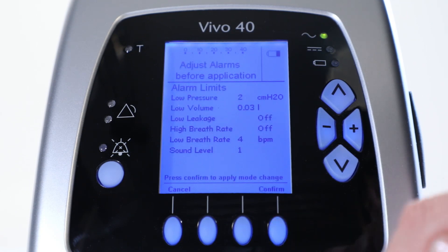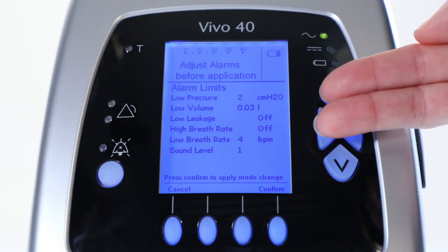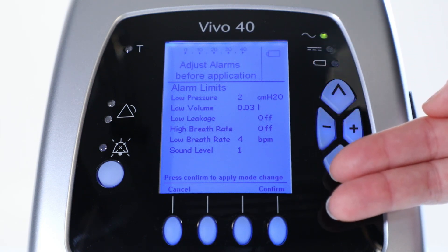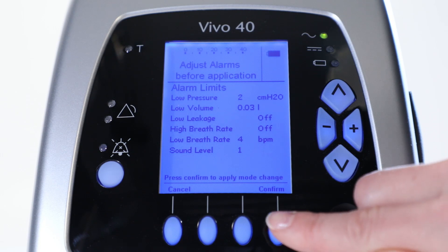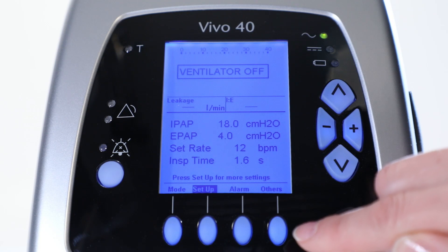Press next to confirm the parameters. You are automatically guided to the alarm menu where you can select which alarms you want to use to make sure your patient is treated in a safe way. Now you have to press confirm to apply the mode change.